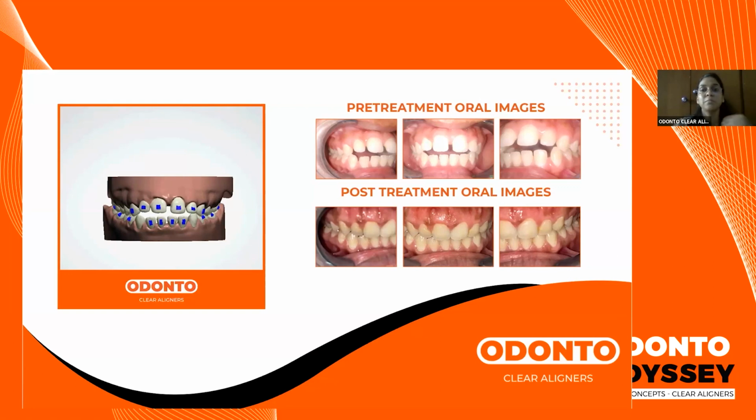Now, what comes under mild category is up to 2 millimeters. Anything up to 4 to 6 millimeters will go into your moderate category. Beyond that, a correction goes into your severe category. This is in terms of linear movement. If we are talking about rotations which are present, then those rotations, we can say up to 15 degrees, mild category can be easily done.